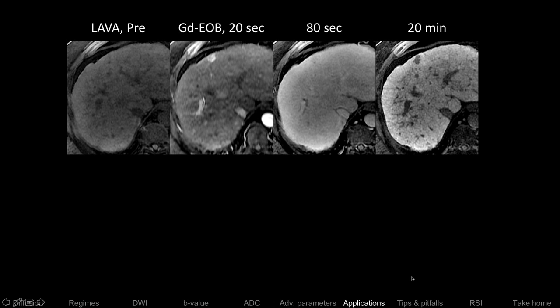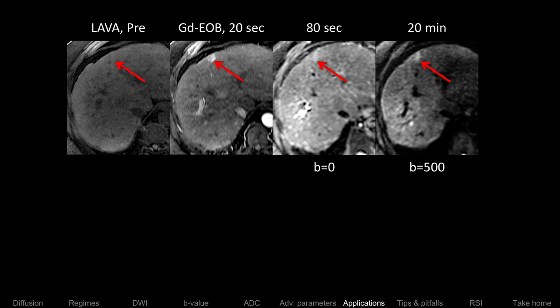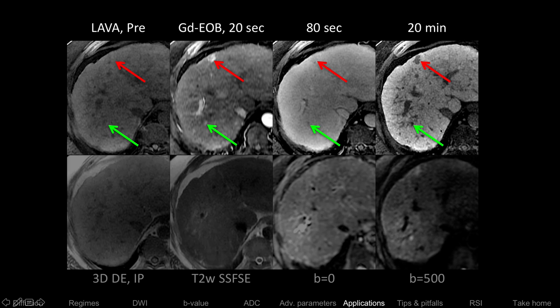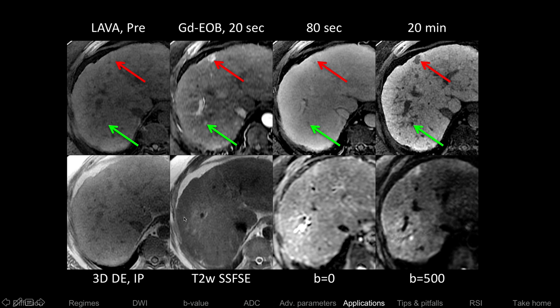Another case: one HCC clearly visible, but there's a second one that appears on diffusion. Where was it on the arterial phase? Right there. And in the hepatobiliary phase. It was really the B500 that allowed us to see that additional cancer. What about T2, in/out of phase, B0? No — it was the diffusion that found the extra cancer. Diffusion can be a very powerful conspicuity sequence.